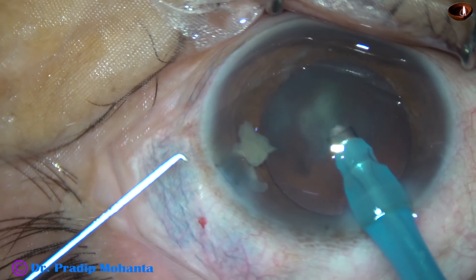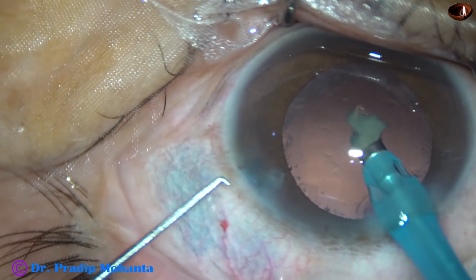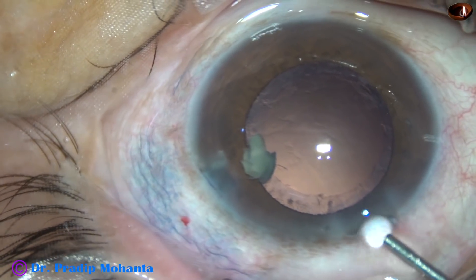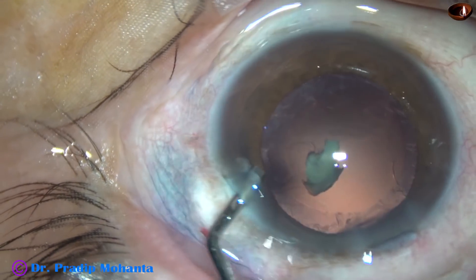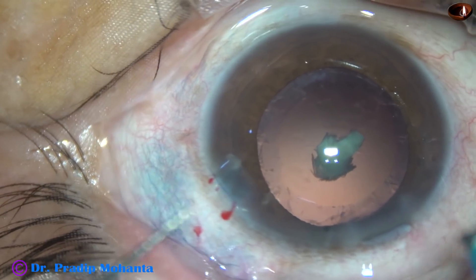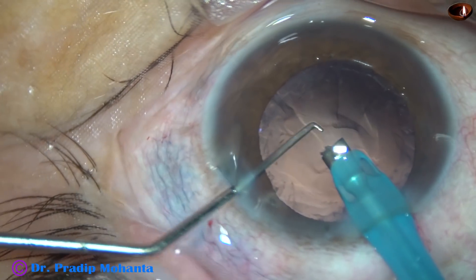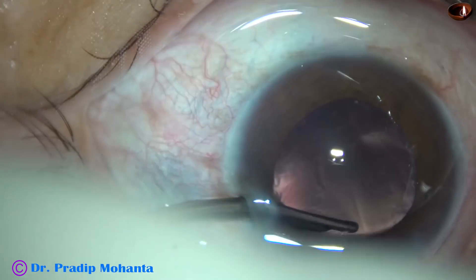This time, I have removed the chopper to get a more stable anterior chamber. One additional precaution I took at this time is I didn't try to remove this piece of nucleus immediately. I have asked for visco — this is HPMC. I apply this to push the posterior capsule towards vitreous. And now, I go again with the phaco handpiece, and very safely, I could remove the nuclear piece. The rest of the video is going to be edited.